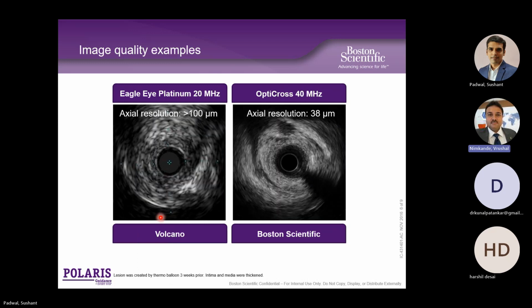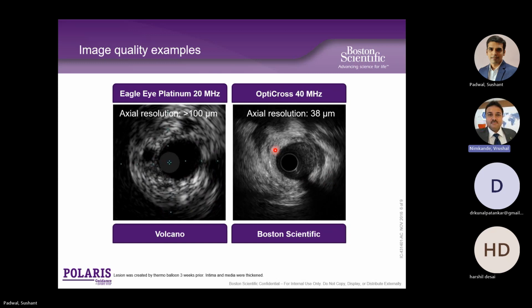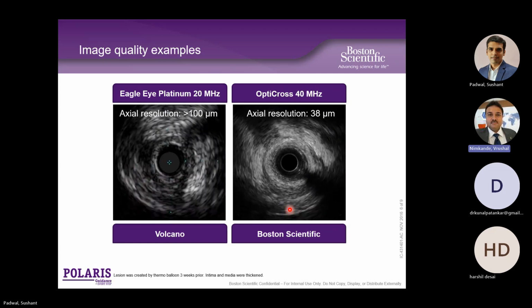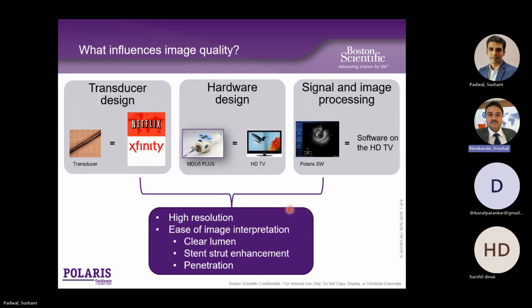The one which we are using is a mechanical transducer, also called a rotating transducer technology. Sushant, go on to the next page, I think he will be able to show you the difference between both the technologies.